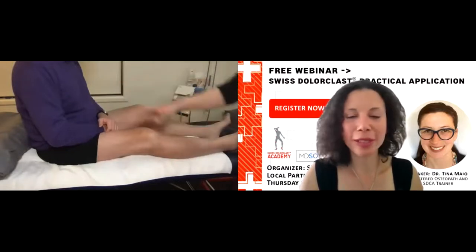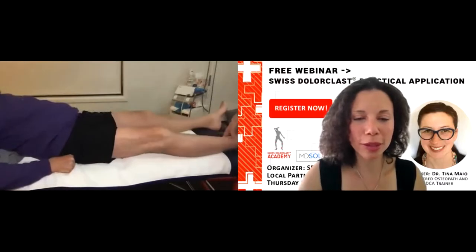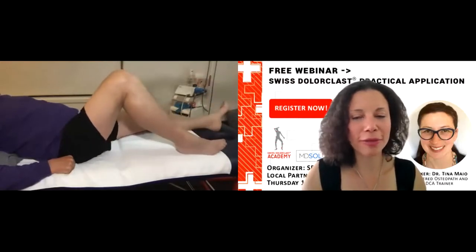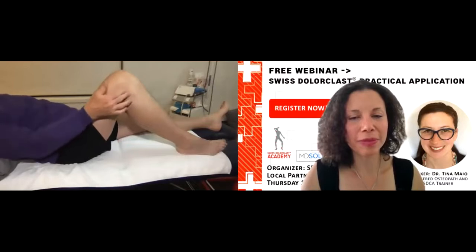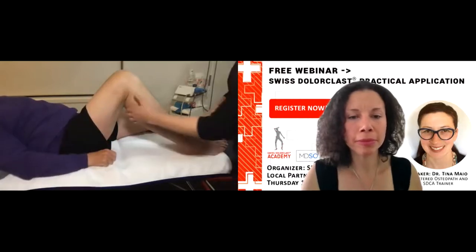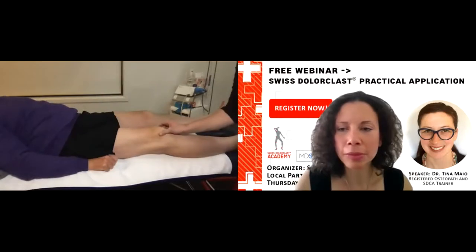Can you lie down, Mark? And just to where you're comfortable, bend the knee by yourself. Let's see what you've got at the moment on your own. Is there pain or discomfort there? Discomfort here. Yep. And pain in the back where I got that cast damage from the original cast. Remember I told you? Yep. So tightness back in there. Okay. So his kneecap doesn't move very well.